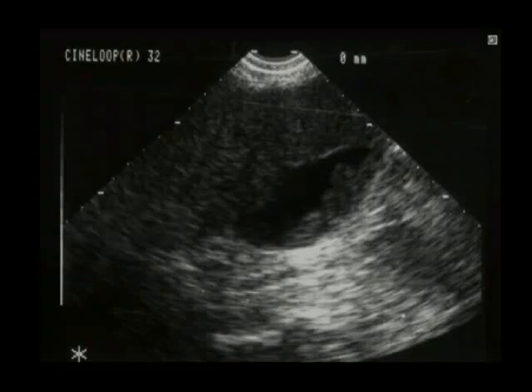Question? Do you not call that sludge? No, this is not sludge. Sludge will actually layer. Okay, but you can see that it's not layering here. But sludge will have the exact same consistency.